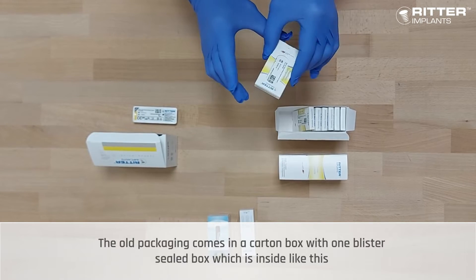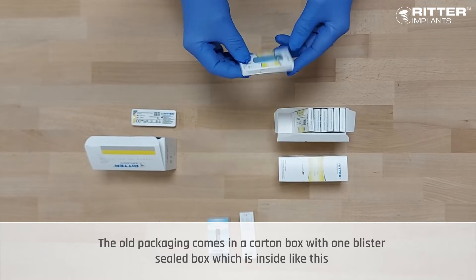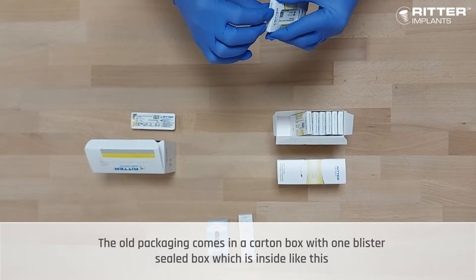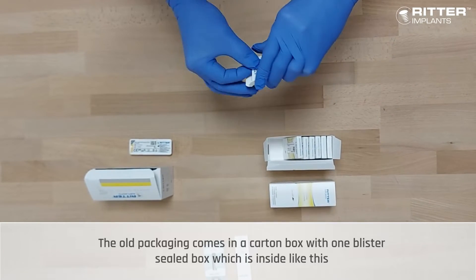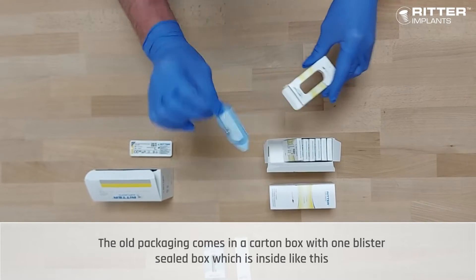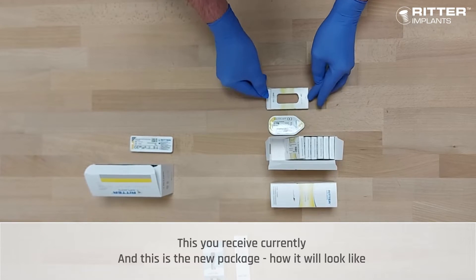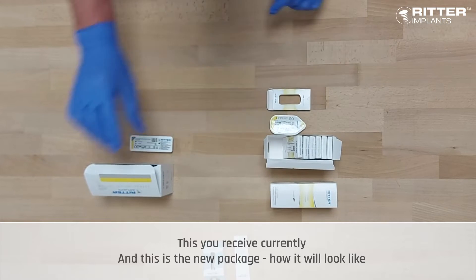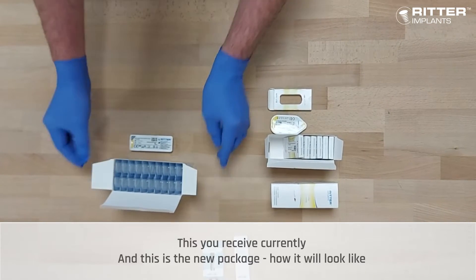The old packaging comes in a carton box with one blister sealed box inside like this. This is what you currently receive, and this is the new package and how it will look.